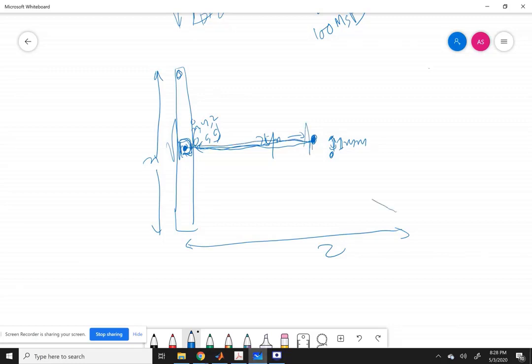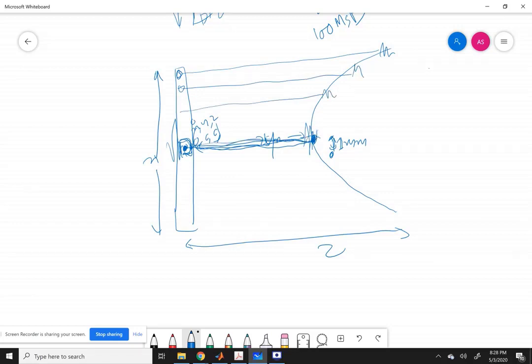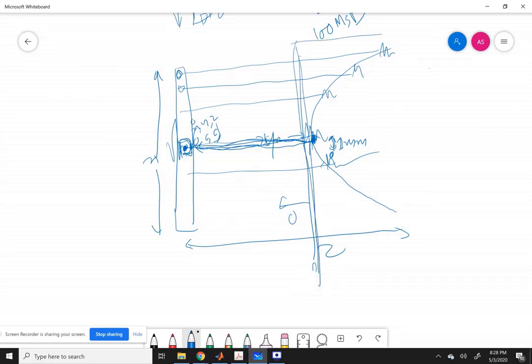So what you'll get is a bow shaped signal. For this transducer you'll get a signal here, for this one it will get a signal here, in the time domain. But before this time period every other transducer has zero amplitude. No transducer is getting any signal before this time. That's why we only record the signal from the start time onwards.